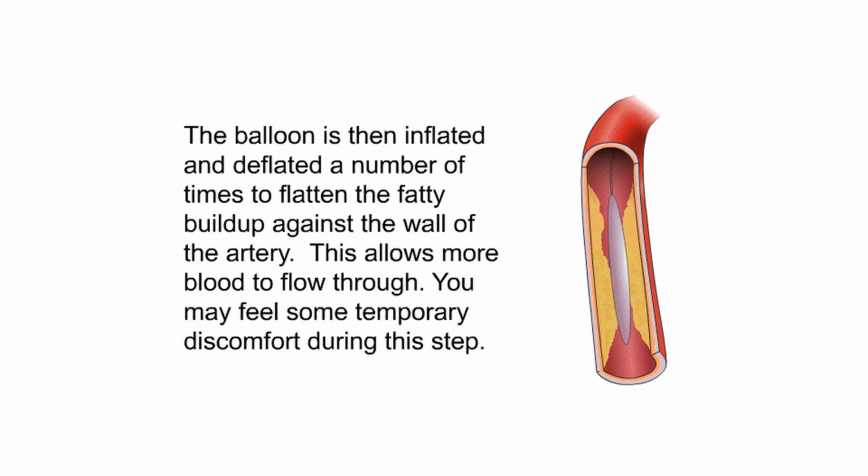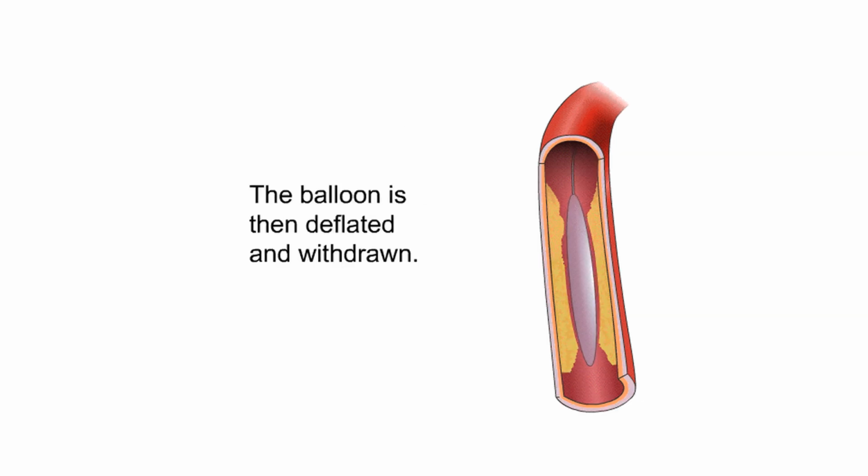The balloon is then inflated and deflated a number of times to flatten the fatty buildup against the wall of the artery. This allows more blood to flow through it. You may feel some temporary discomfort during this step. The balloon is then deflated and withdrawn.